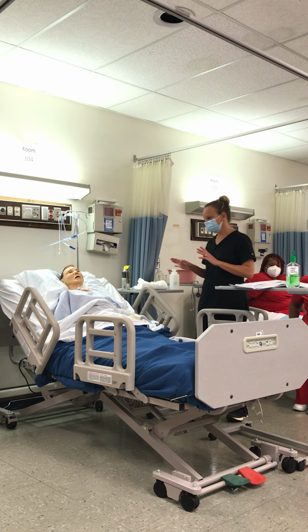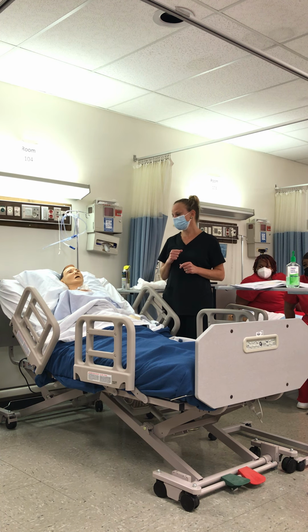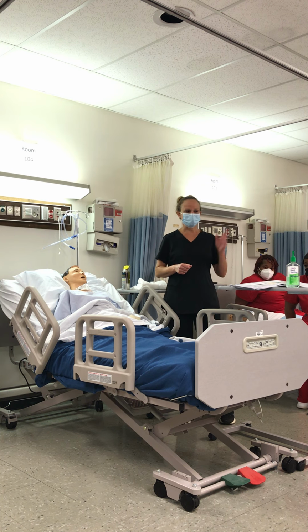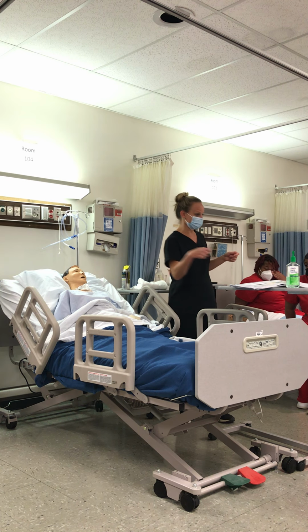So now I've chosen which side, and I've chosen that I want to go into this right side. Would I go to that side to put it in? I'm left-handed, so I'm not going to that side, because I'm going to feed this way, not this way.